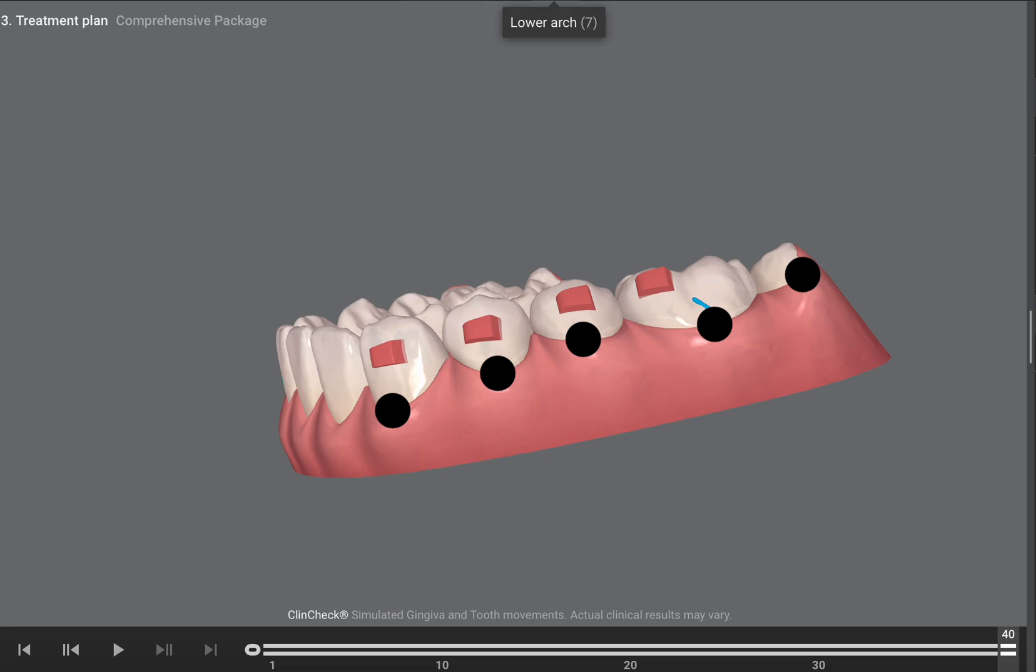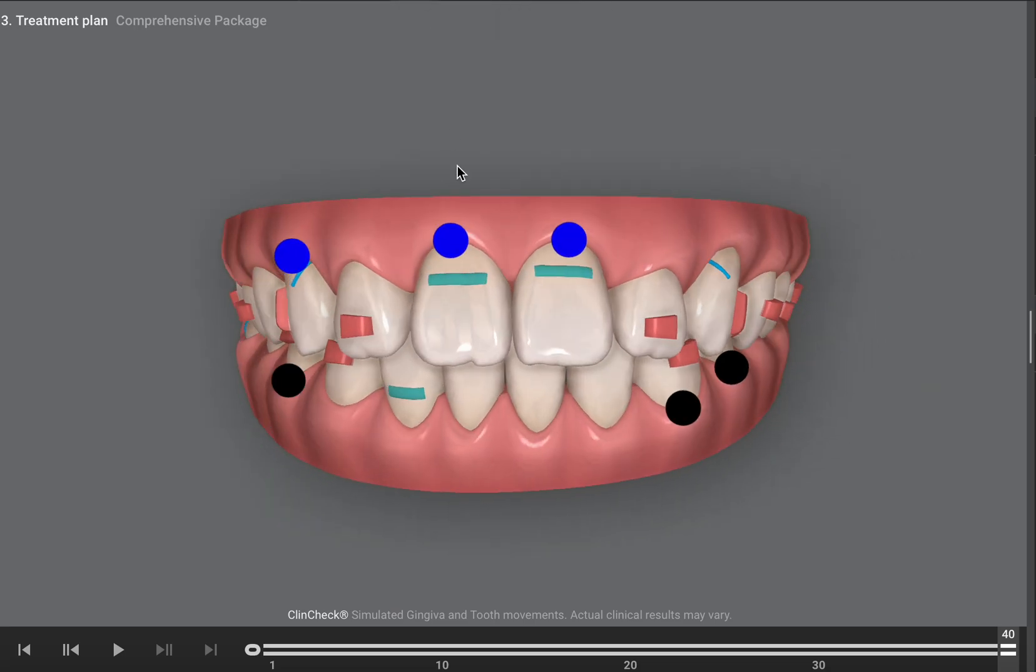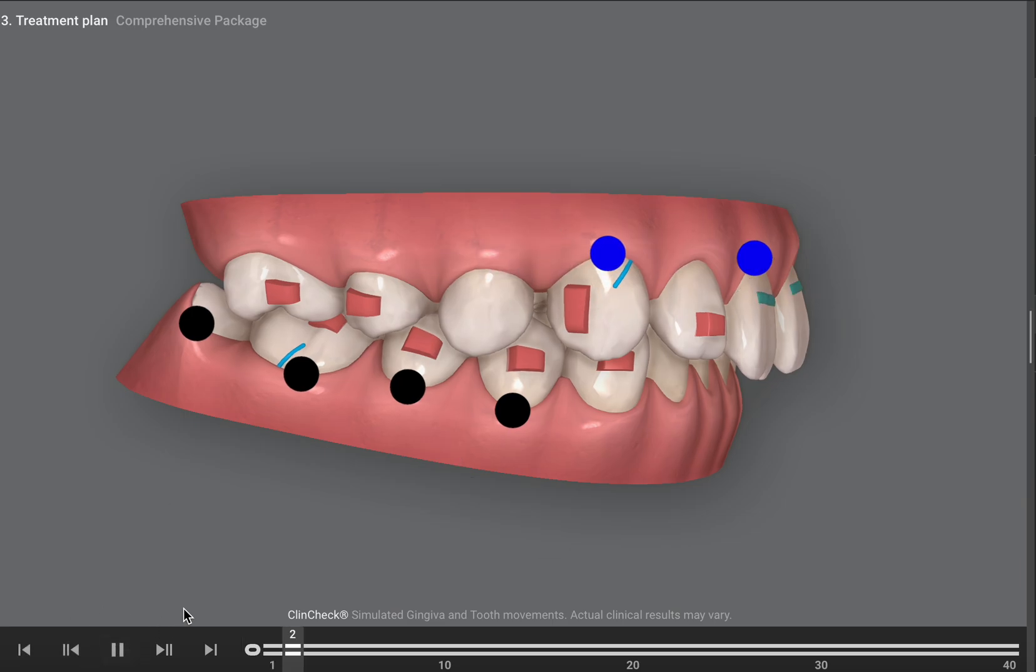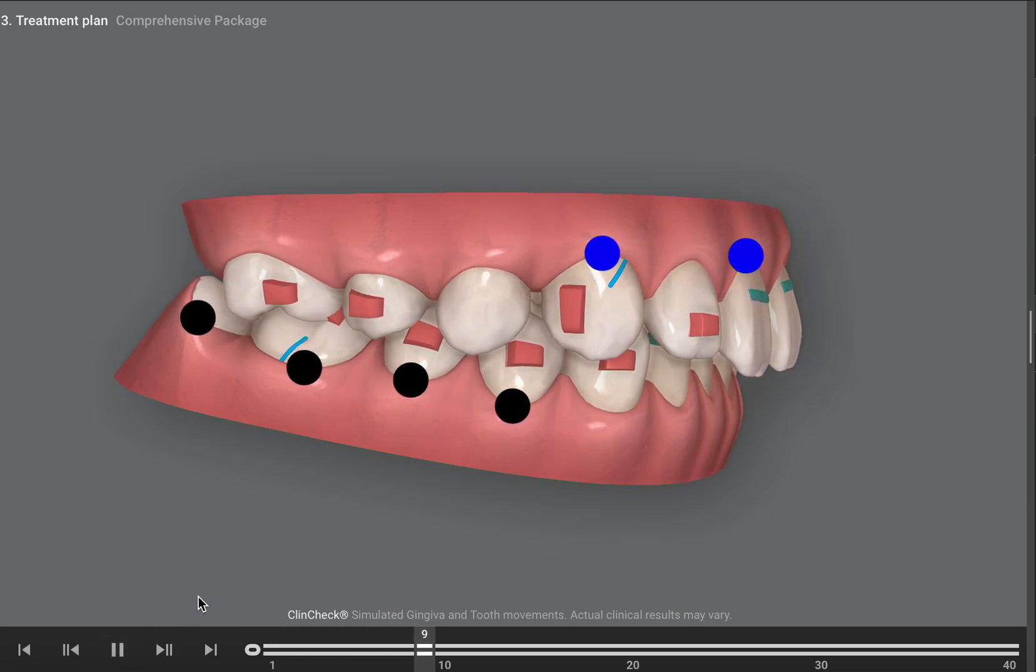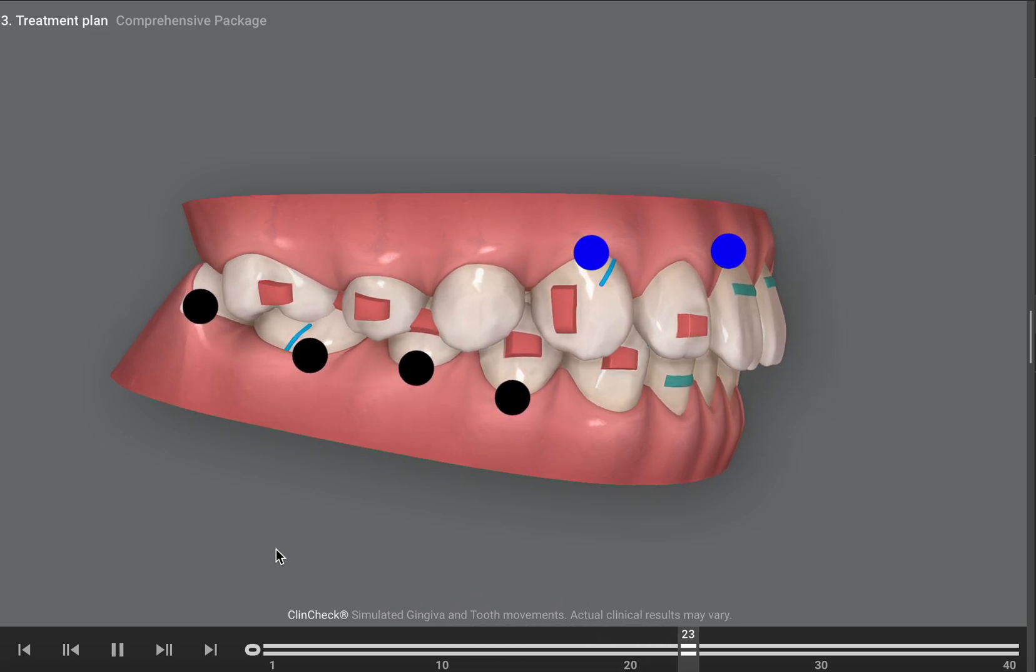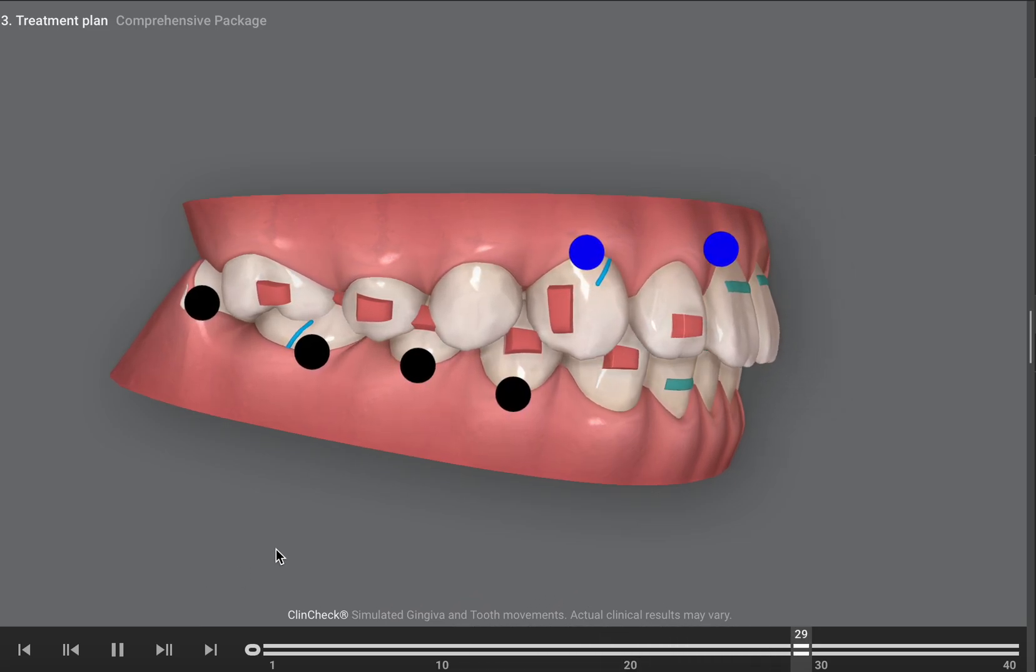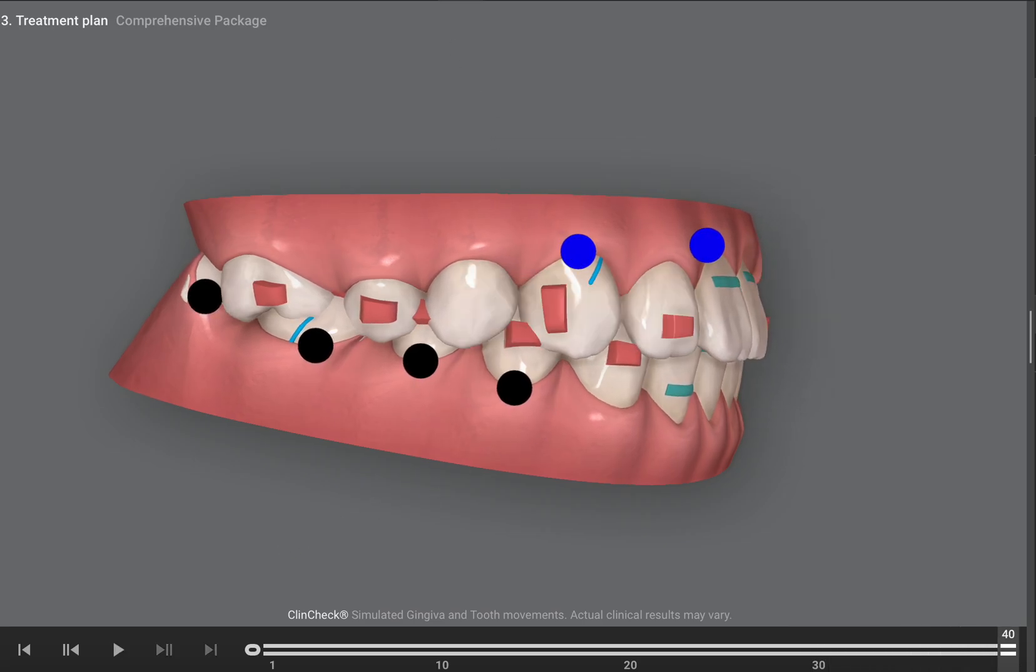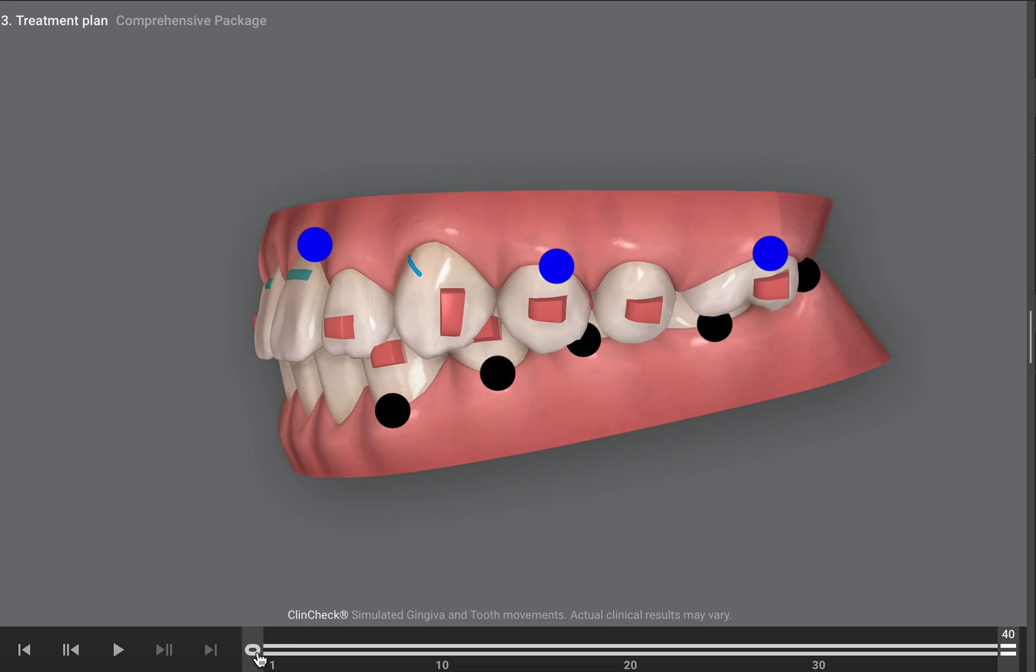Another tip is for this kid - he wasn't a class two to begin with, so you see he's got class one molars. But I've added elastic cuts and perhaps we can make the child wear really light elastics at night to help with that anterior retraction. So just some light elastic. To be honest, I think it'll work even without him wearing any rubber bands.